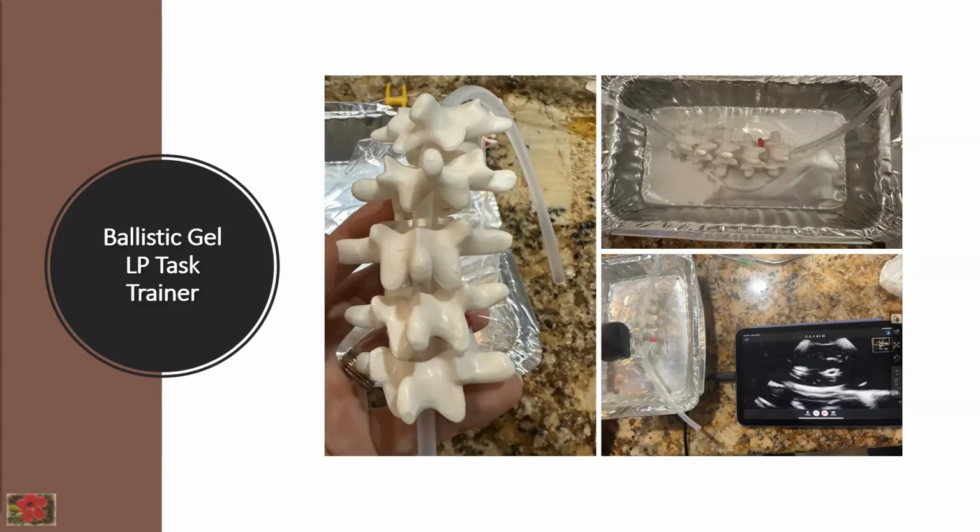And then for some of the material, it's really trial and error. Sometimes the gel is a little too hot for whatever material I'm trying to put in it. So I may let it sit for 10 to 20 minutes and let that initial heat wear off. And then I'll input whatever I'm using for the trainer, whether it's a metal skewer for vessels. I will put in a long skewer sometimes and then let it cool and remove that afterwards. Latex tubing I've used, or for my simulated heart chamber for my UVC, I will put in a ping pong ball with a latex tubing attached to it, and then remove the ping pong ball afterwards. So it ends up being a negative space of a circular chamber.